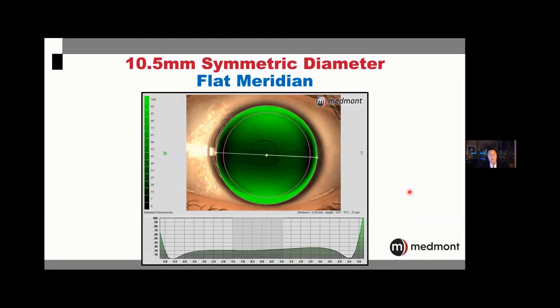Well, let's use the contact lens software. And this is a function that we use all the time at the school. The benefit of this is it allows us to place a rigid contact lens on eye and model its fit, manipulate its parameters, create the best possible lens to cornea relationship before we either order a lens and wait for it to come in or put a diagnostic lens on eye and find out that we're either too steep or too flat.